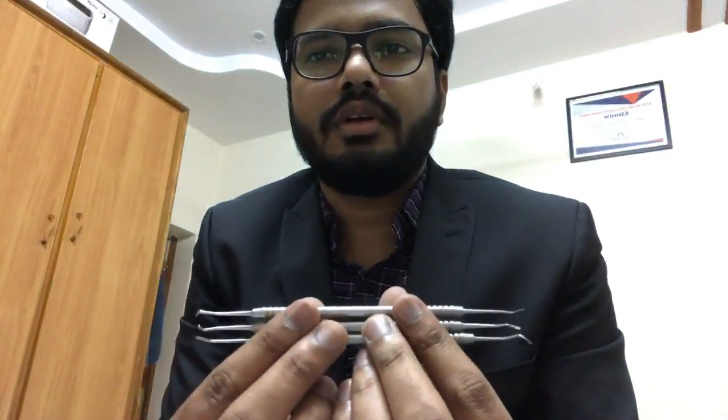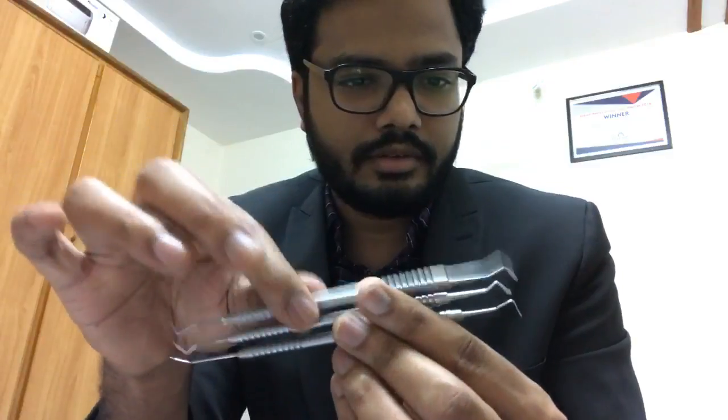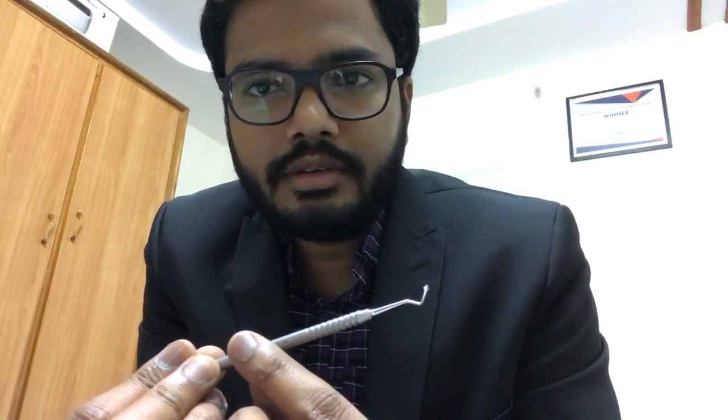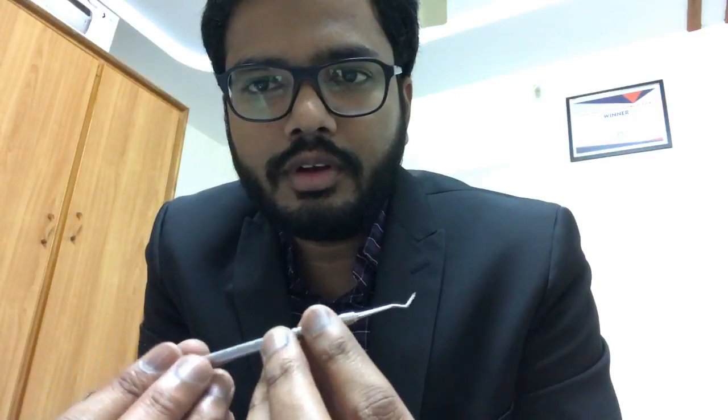Yeah. So identify these three set of instruments. I think it's difficult, so I'll project one at a time. So focus on this part, I'll show you the other part later. So these are all carvers, right? Hold on, let me just show you. Yeah, now, is it Hollenbeck, Wards, or diamond carver? You have the diamond shape, so easy to identify, isn't it? Cool, so diamond shape carver.